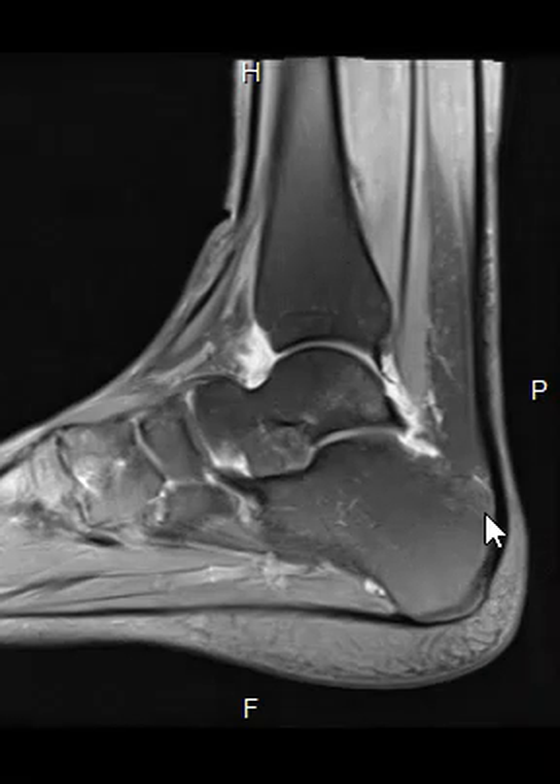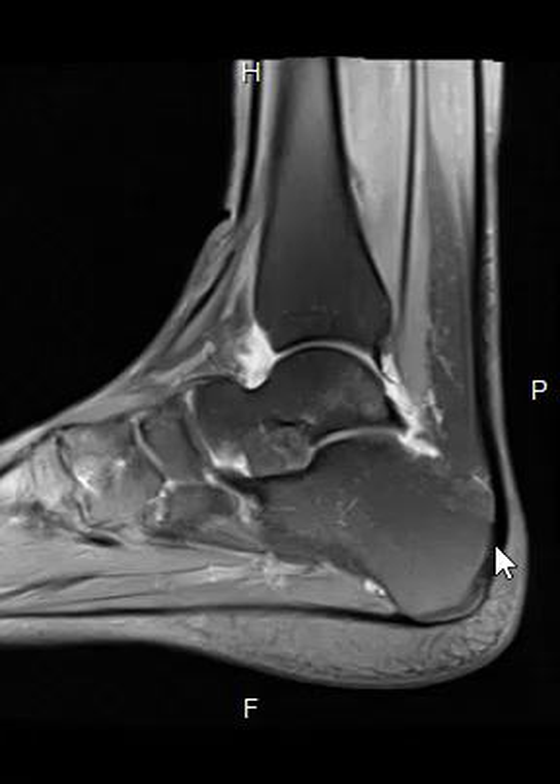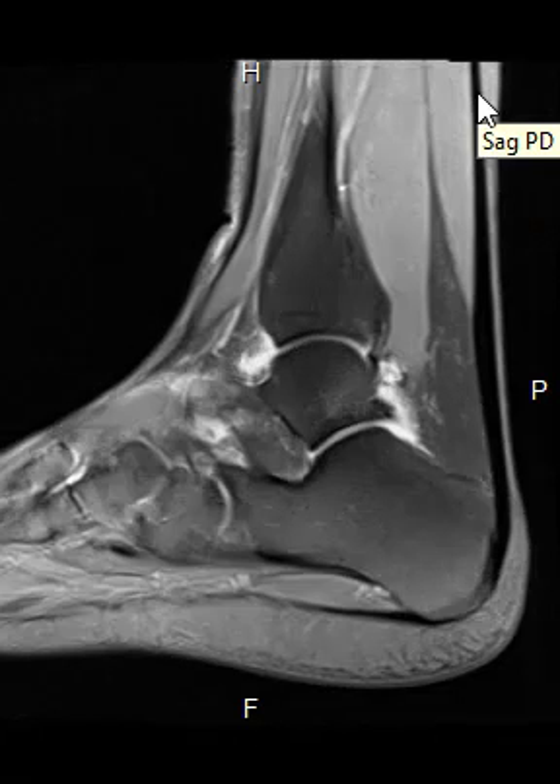Hello, this is Dr. Gay, and now we're going to take a look at an ankle — just a kind of bread-and-butter ankle case here. This is a side view of the ankle. In the back here we see this dark band; this is the strongest tendon in the body, called the Achilles tendon. You can see this gray stuff is muscle.